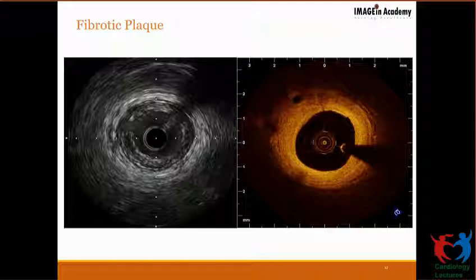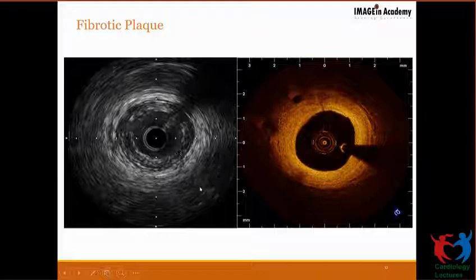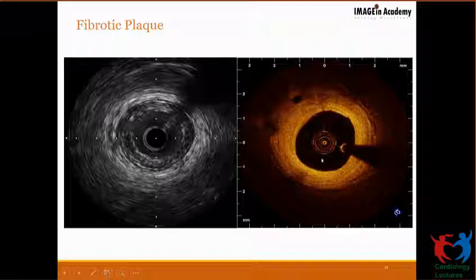Now there is a fibrotic plaque, and look at the IVUS image. We cannot really make out to a great extent what exactly it is. And look at the OCT image. It gives you the complete morphology of the plaque with thickness, and you can see a microchannel at around the 11 o'clock position.